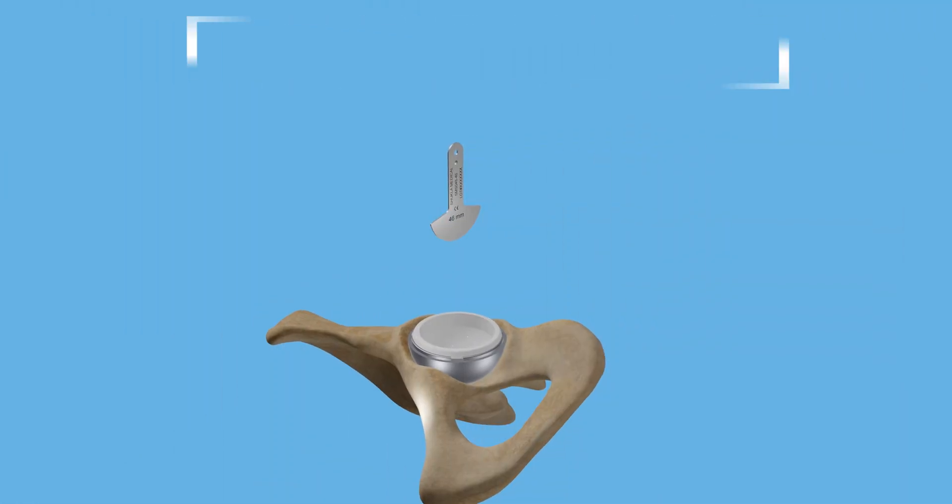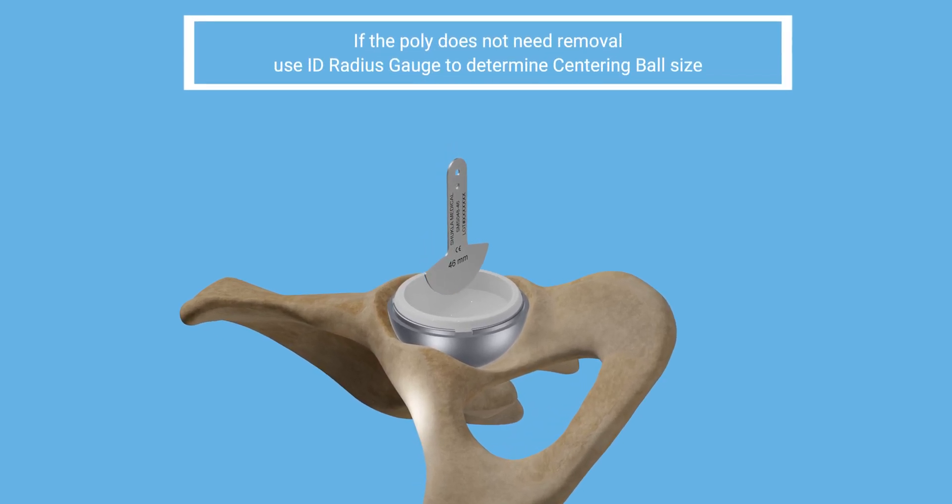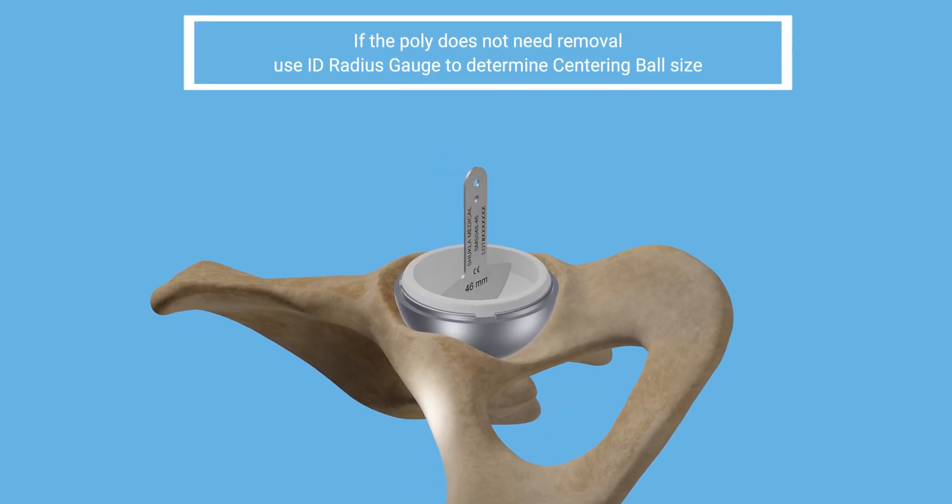To measure the cup liner's inside diameter, start with the ID radii gauges. Select the best fitting gauge and match it with the corresponding centering ball diameter.